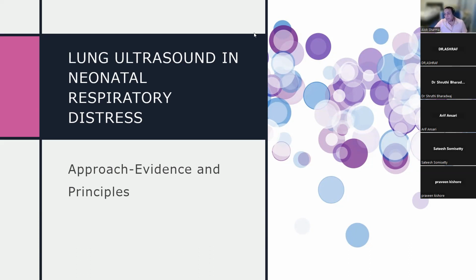Yeah, absolutely. I know for a fact that some people will treat the ultrasound as well, and I think that's where I would say that maybe in a few years, we trained 35 people in our first batch. We're training another 35 of you who I know are all doing ultrasounds. I'd be really keen to ask you what conclusion you come to. What is your clinical guess for how we should be managing those babies?